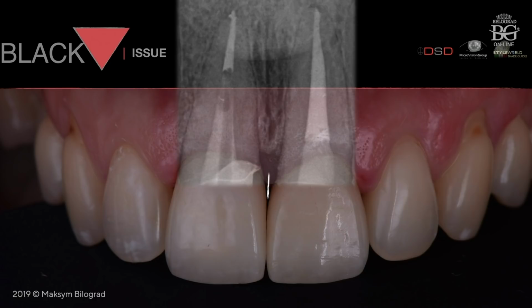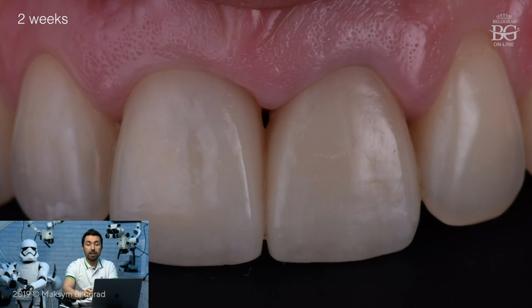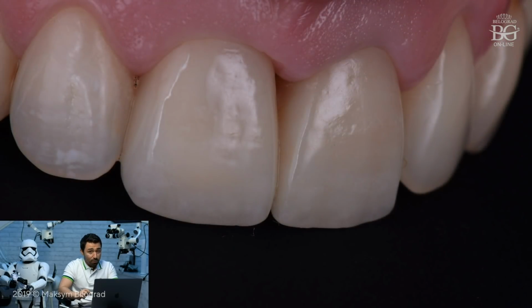In our case, we use this calibrated ruler. It's about 5 millimeters, so we can expect the growth of papilla in interdental areas. This picture is after 2 weeks. You can see that the papilla is on its way. It's just a small piece of papilla that will definitely be filled in a while, but unfortunately I don't have another picture because the patient was from another city.